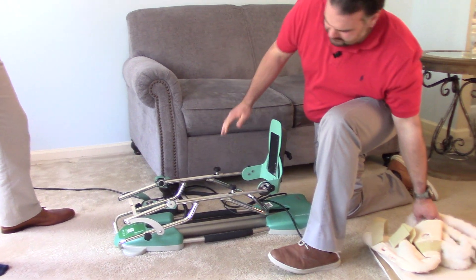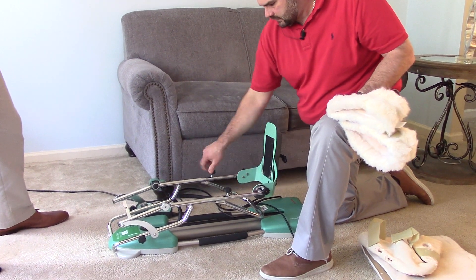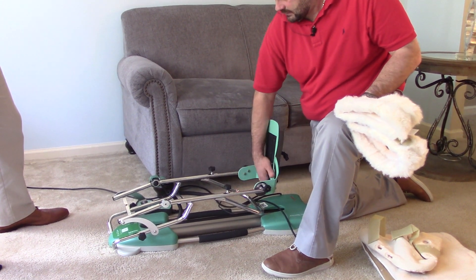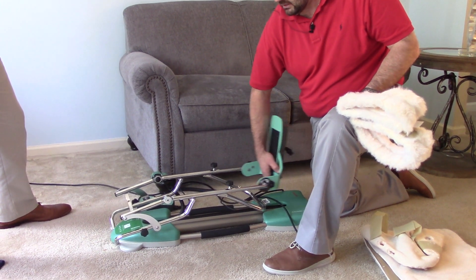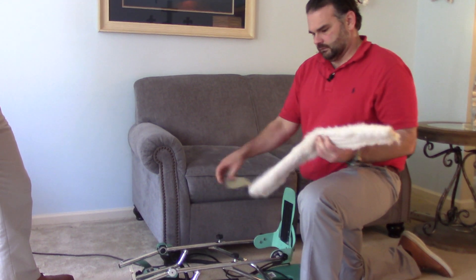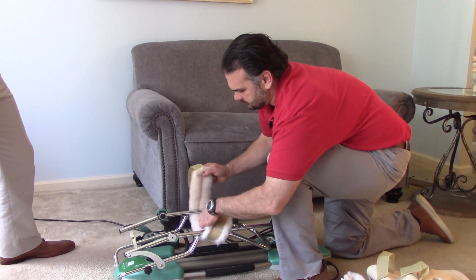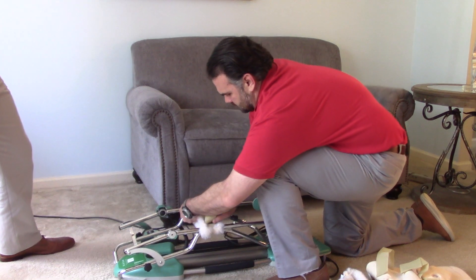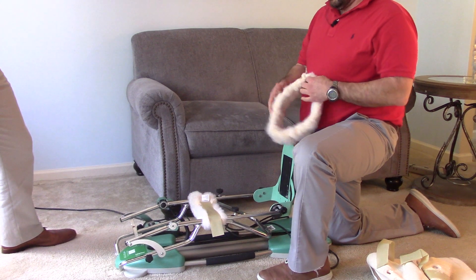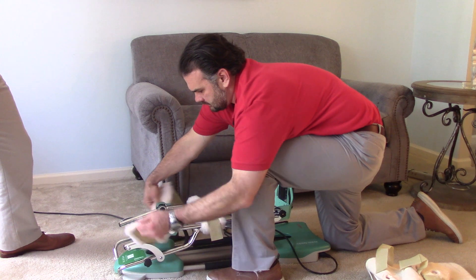Next, we've got to get the correct length from the knee to the bottom of the foot. We're going to go ahead and loosen these knobs, and it's going to allow us to slide this piece in and out. Typically, we'll go ahead and take one of these straps and strap it around here, and then take the other strap and it's going to go here.